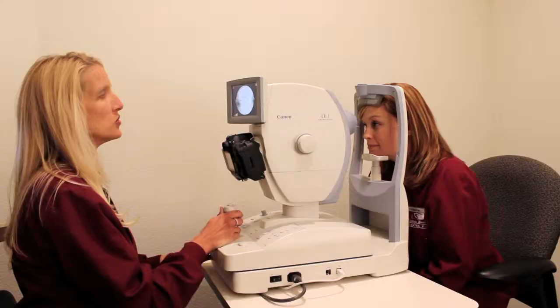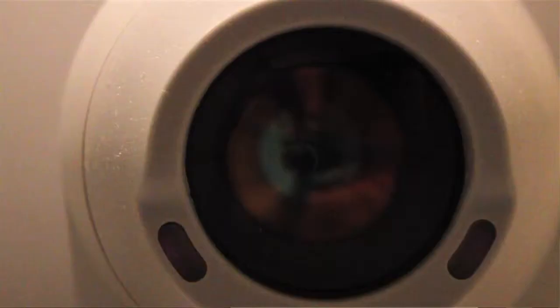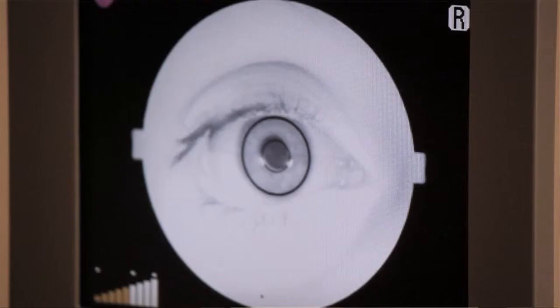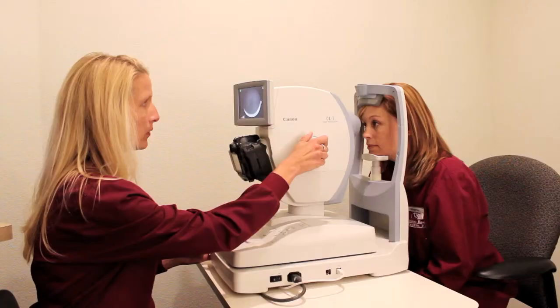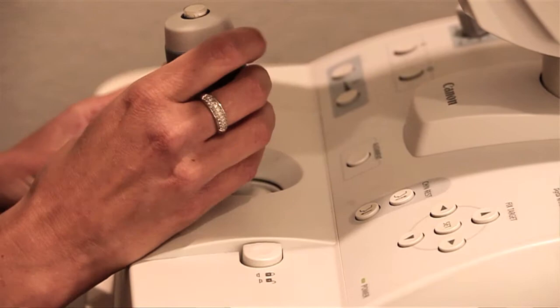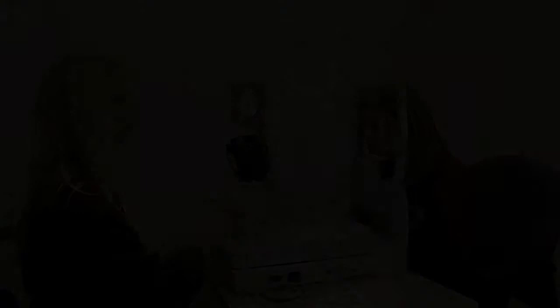I'll have you put your chin here, forehead against the bar for me, please. I just need you to look right at the green light that is in there for me and stay focused right on that. Just look right at the green light again, please. Very good.